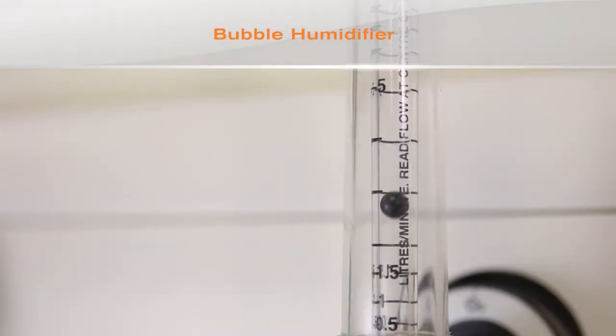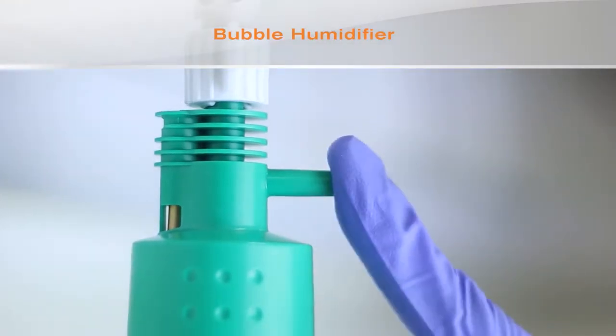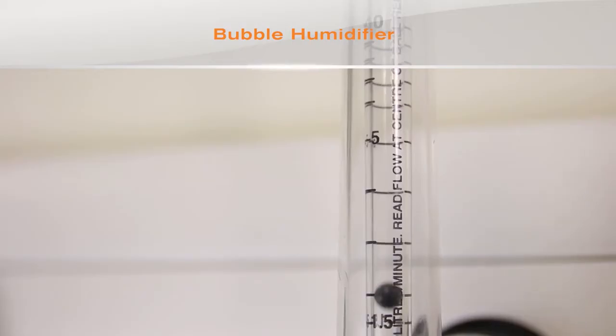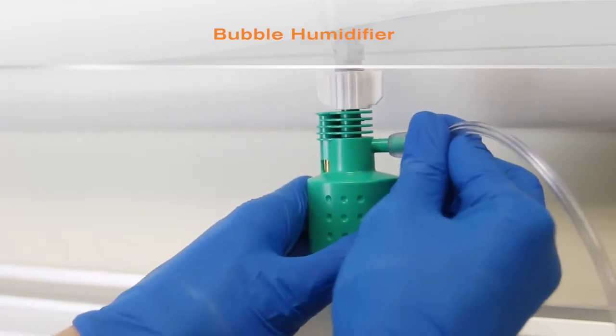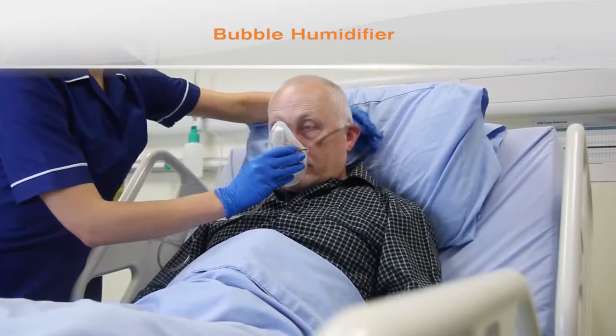To test the pressure relief valve, adjust the flow meter to 4 litres per minute and occlude the outlet. Verify that the relief valve operates within 5 seconds. Reset the oxygen flow meter to the appropriate flow for the patient. Attach the oxygen tubing to the bubble humidifier and the delivery device and fit to the patient.